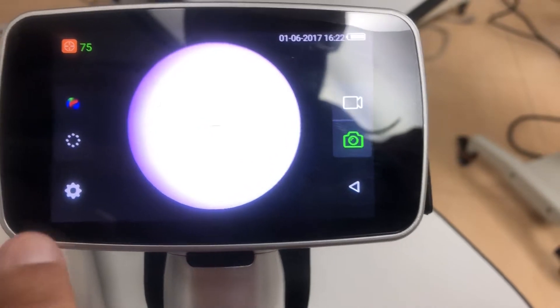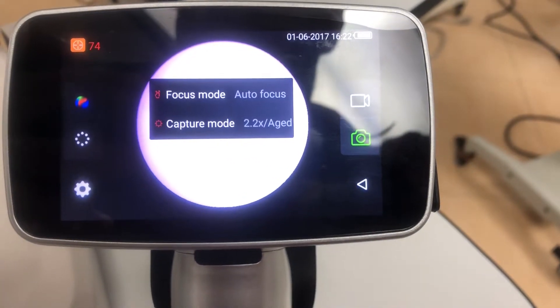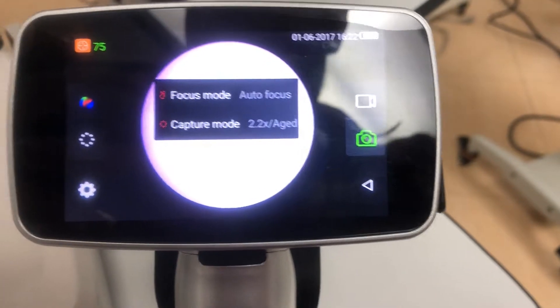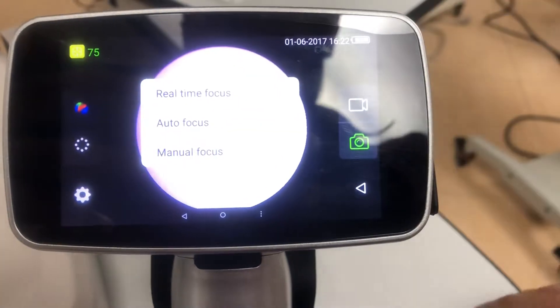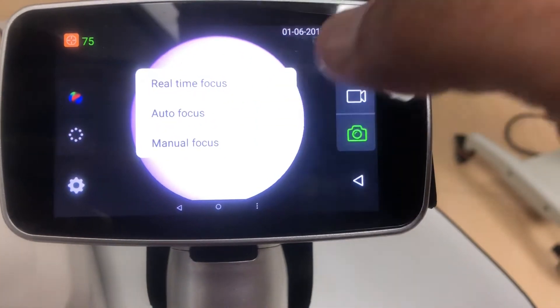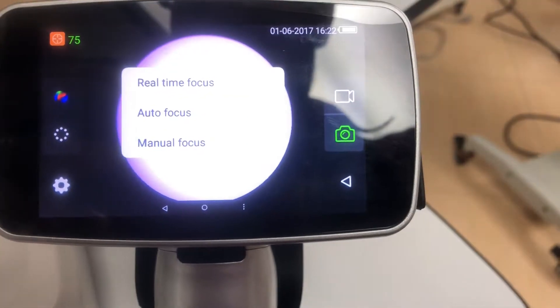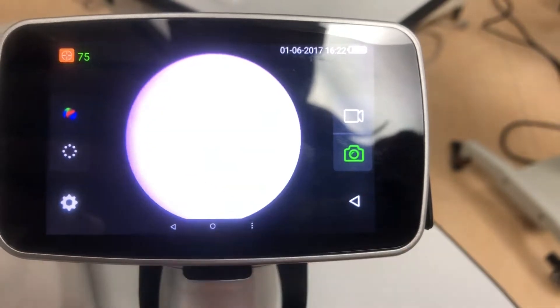Here we have the Settings menu. Under focus mode, we have real-time focus, auto focus, and manual focus. The majority like to use it on auto focus.